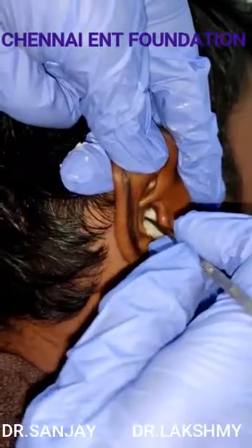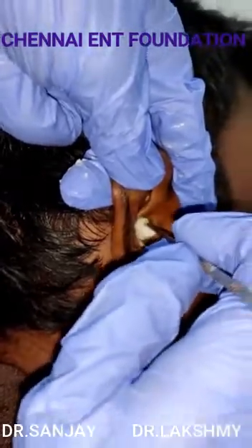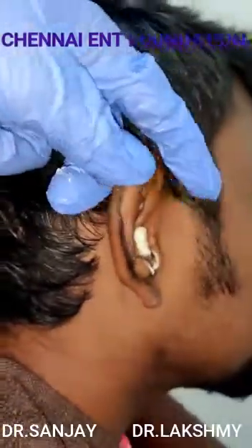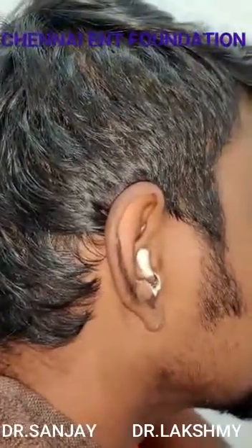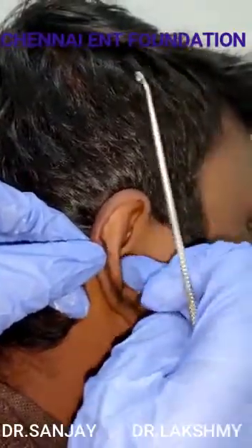As you can see, you push only on the cotton wick — do not touch anywhere on the canal and cause trauma. Push the complete wick inside, leaving a little bit outside so you can pull it out easily later so that it doesn't get trapped inside. Then keep a cotton ball over it. This is how you do it. Thank you.